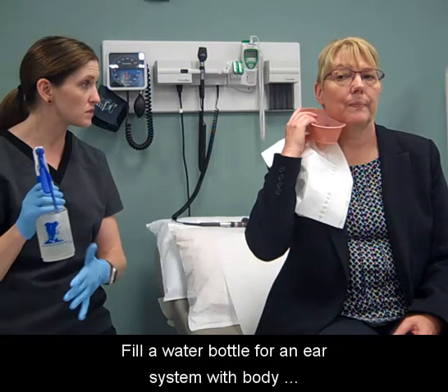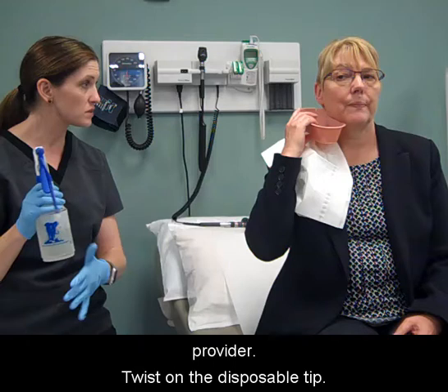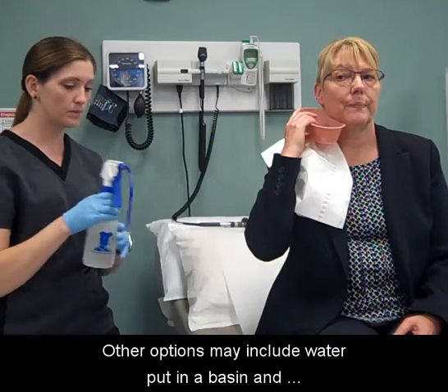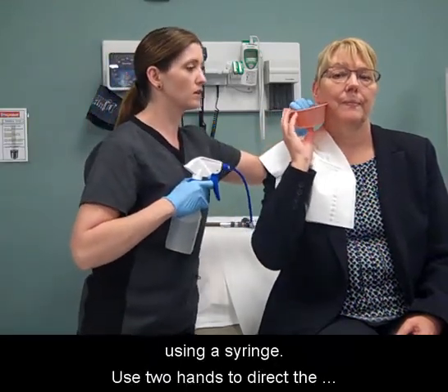Fill a water bottle for an ear system with body temperature water or other solution ordered by the provider. Twist on the disposable tip. Other options may include water put in a basin and using a syringe.